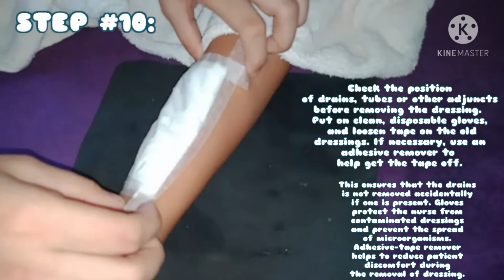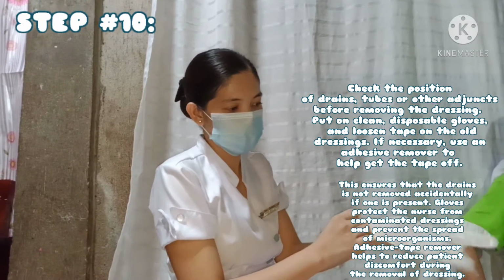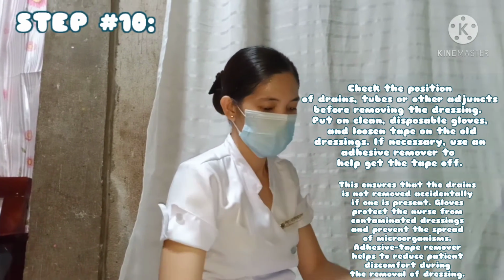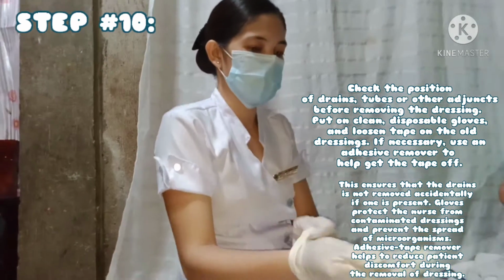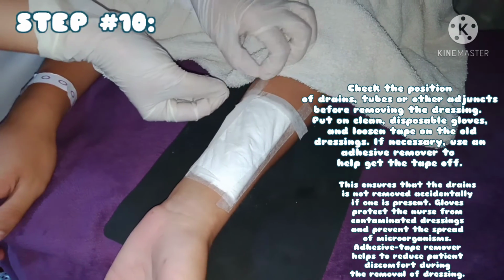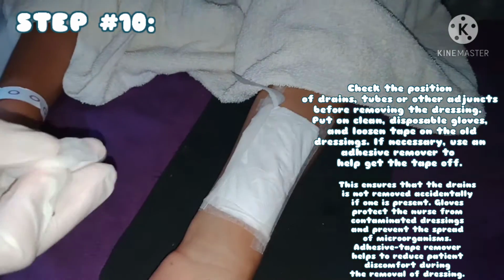Step number 10. Check the position of drains, tubes, or other adjuncts before removing the dressing. Put on clean, disposable gloves and loosen tape on the old dressings. If necessary, use an adhesive remover to help get the tape off. Checking ensures that a drain is not removed accidentally if one is present. Gloves protect the nurse from contaminated dressings and prevent the spread of microorganisms. Adhesive tape remover helps reduce patient discomfort during removal of dressing.